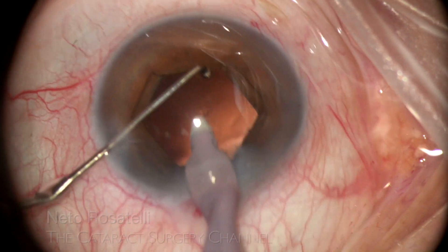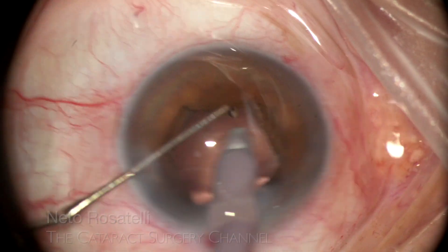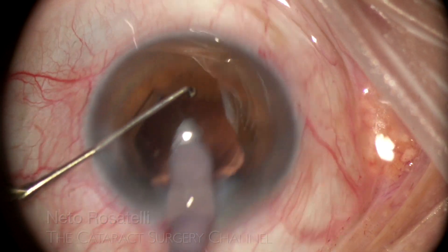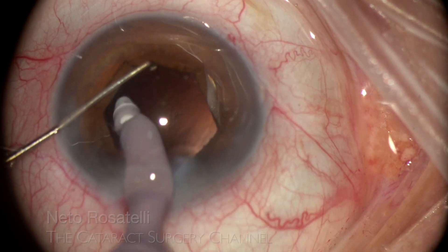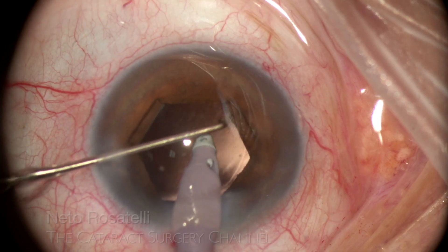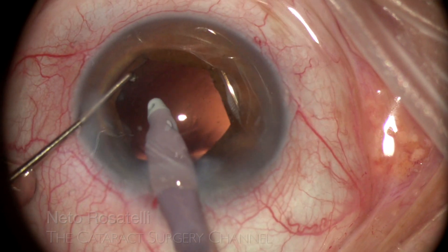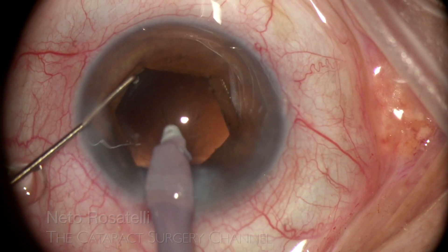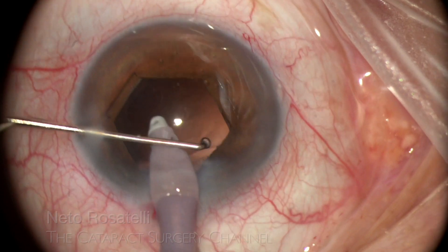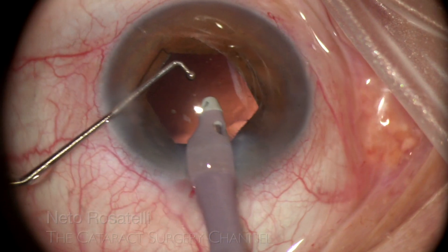The central posterior capsule is polished, and peripheral inspection helps identify any hidden cortex left behind. Little peripheral cortex left behind will be of no consequence. There is only a small center of fibrotic opacity, but let's call it quits.